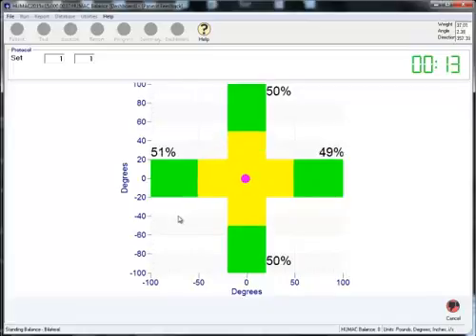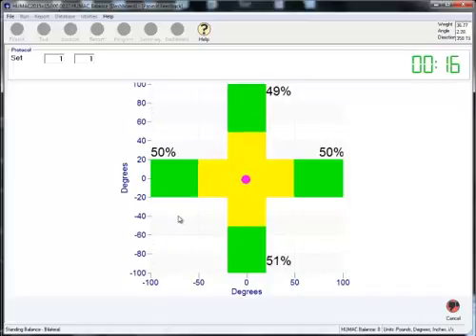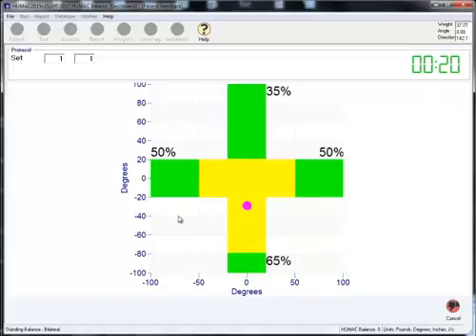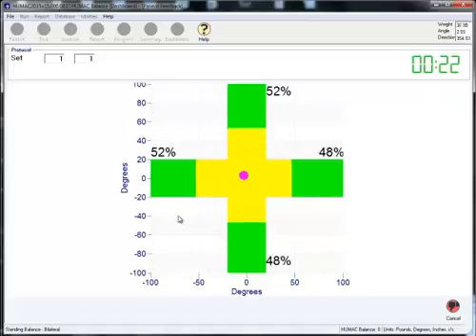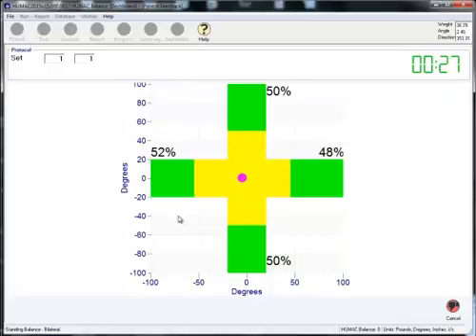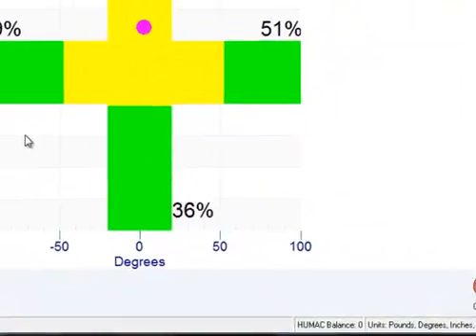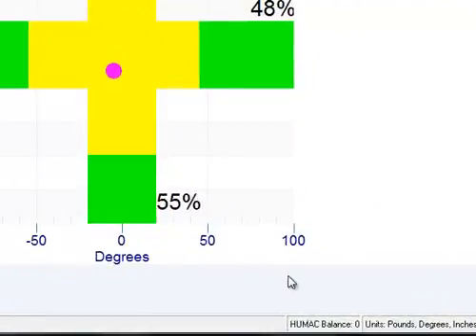With a display like this on the screen, a useful exercise might be a squat where you would expect their center of pressure to move towards their heels. A display like this gives the patient the feedback they need and the clinician needs to help the patient properly distribute their weight as they move from right to left, fore and aft.